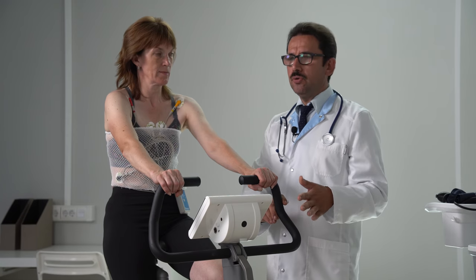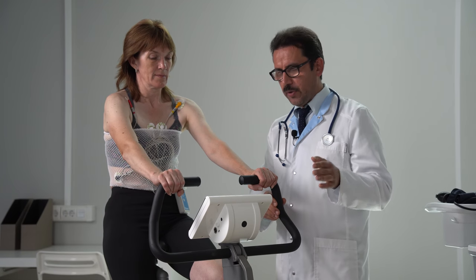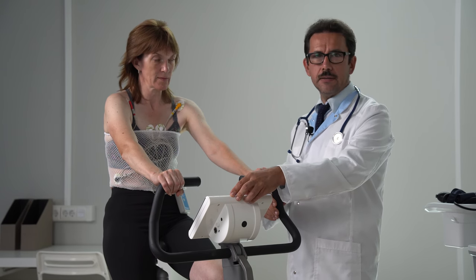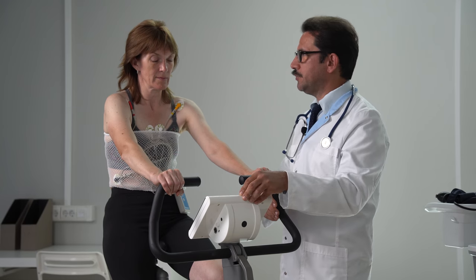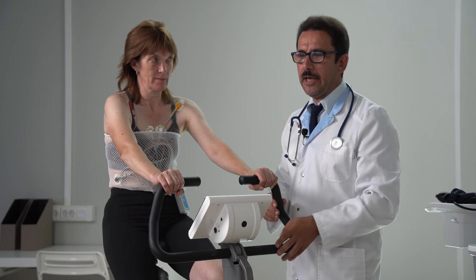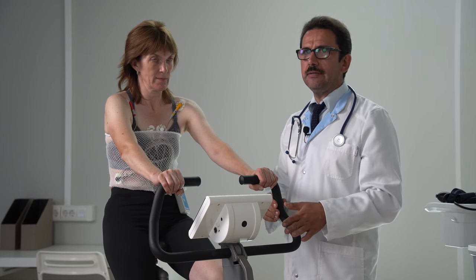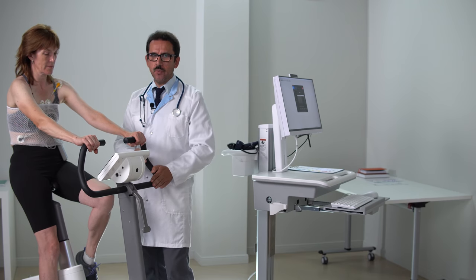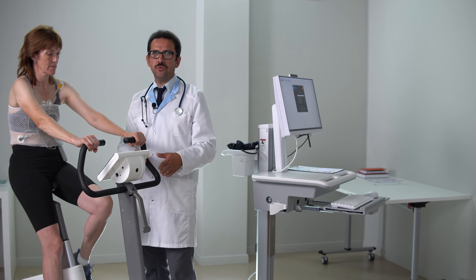Okay, then we need to give some instruction to the patient about the test. So you should pedal at a speed of about 60 revolutions per minute. This rate is indicated here on the screen, and I will control this rate on the PC screen too. I can tell you a different speed, for example 65 or 70, depending on the exercise and your reaction to the exercise. Please pay attention. Now we are dealing with an electronically braked device like this bike ergometer. So it automatically controls the power output in watts. So if I put 50 watts, this system will provide 50 watts independently of the pedaling rate from about 30 to about 100 per minute.